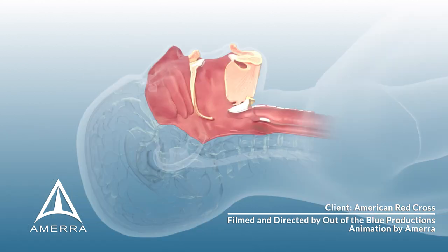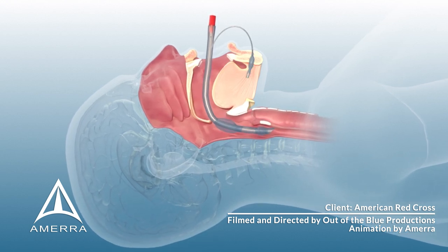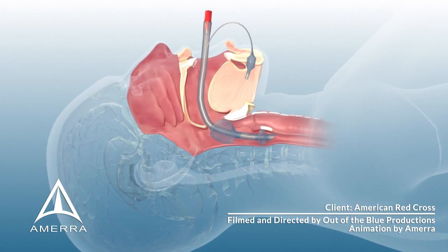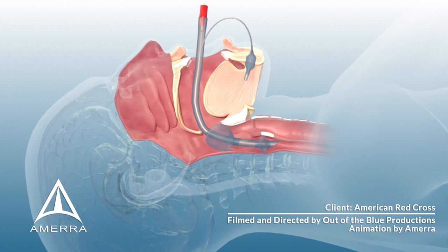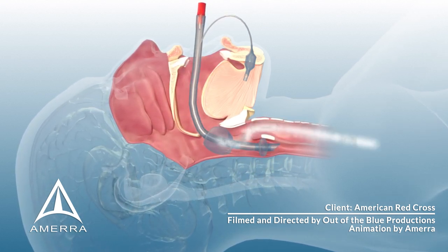The tube is inserted against the hard palate and then advanced down the midline until resistance is met. When properly positioned and the cuffs are inflated, the oropharyngeal cuff isolates the laryngopharynx from the oropharynx and nasopharynx, and the esophageal cuff isolates the laryngopharynx from the esophagus. Air passes through the openings in the tube and into the trachea.